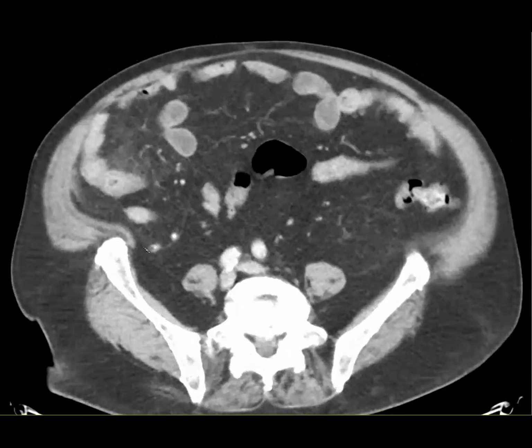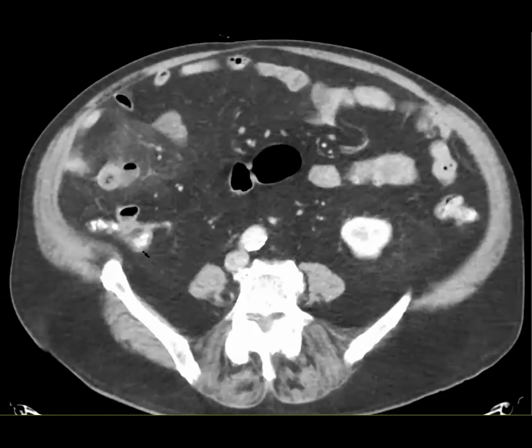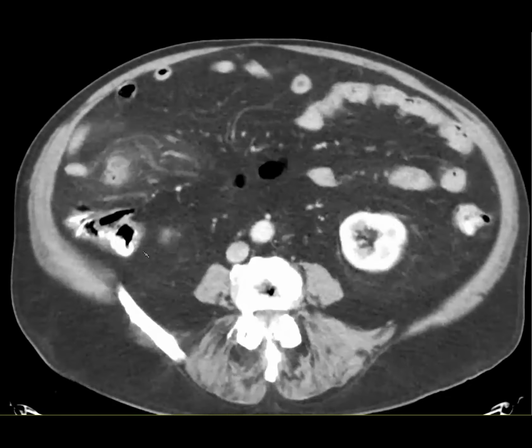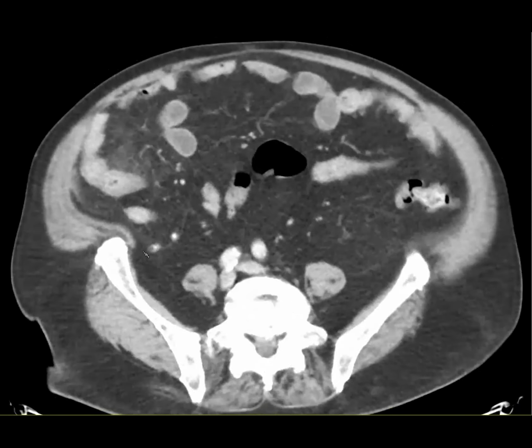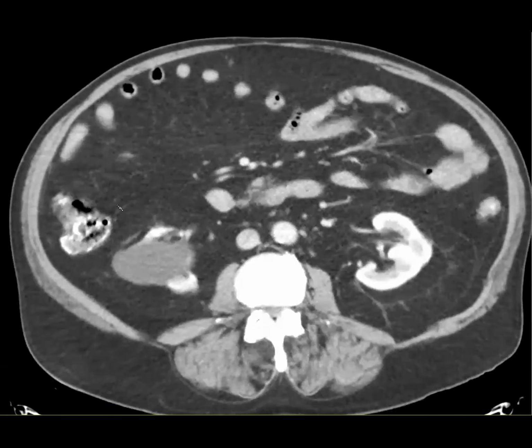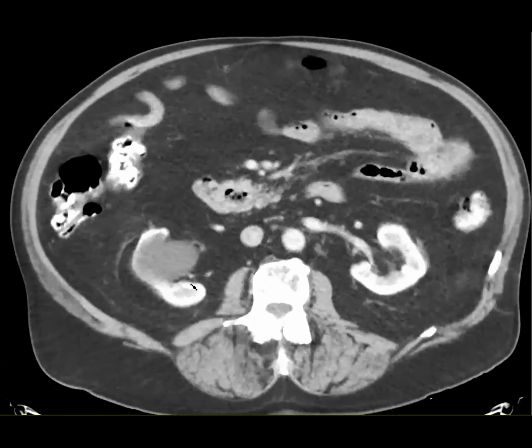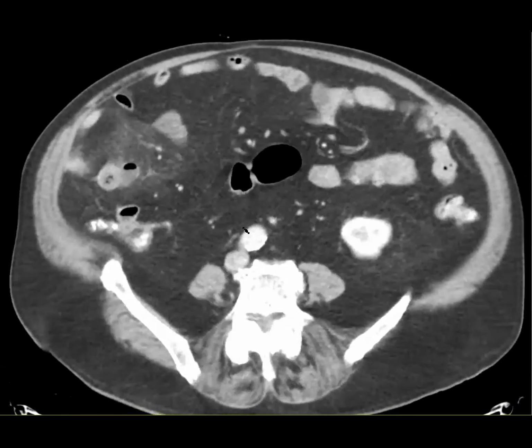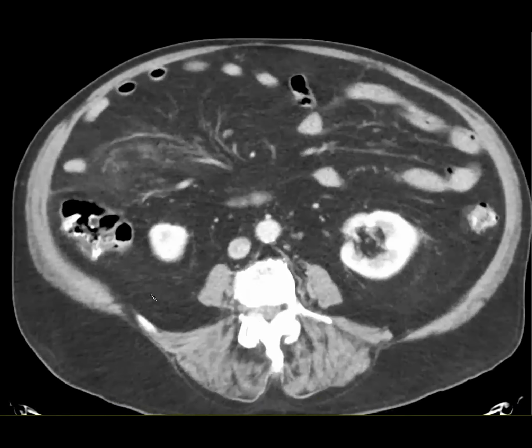That's okay. I just said it was inflammatory changes in the right lower quadrant. It looks like there's a diverticulum off of the small bowel, so I'm most concerned for Meckel's diverticulum that's inflamed. Yeah, perfect. This is a beautiful example of a Meckel's coming off of, looks like ileum. Somebody said jejunal diverticulitis, which could be, but more likely on this left upper quadrant here. So right lower quadrant, we're always going to think about a Meckel's.